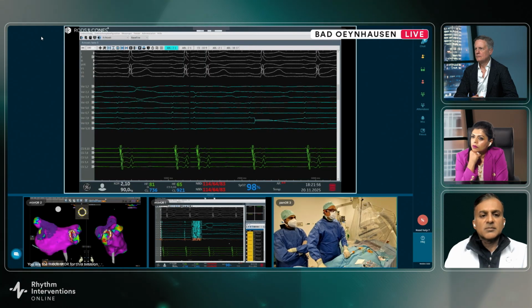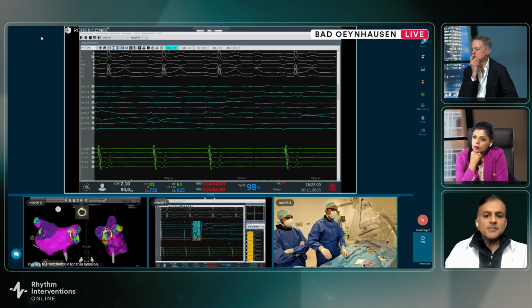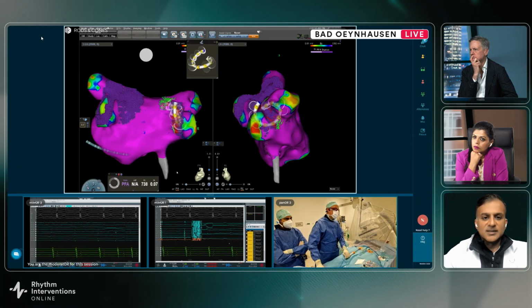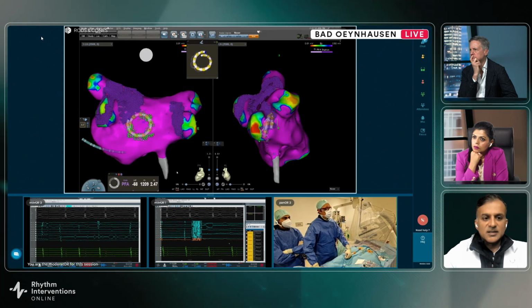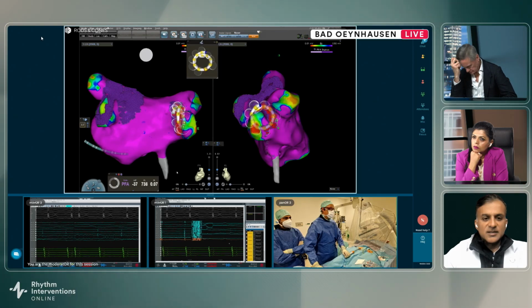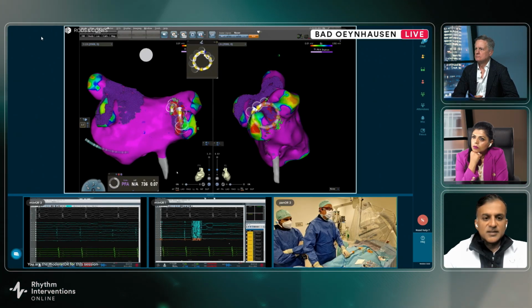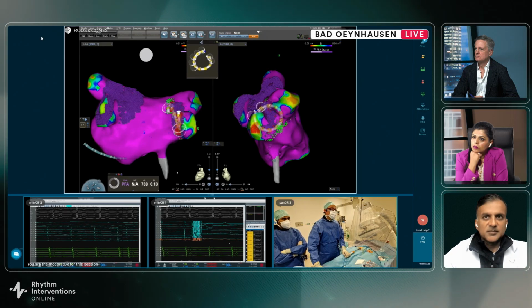We open the catheter once again to cover also some pieces of the maybe posterior parts. Again, you see the majority is now red and we are dropping out. So we need to replace the catheter here once again, going into this area and opening it once again. Everything is red, so the system suggests not to continue ablation, but now here are some green spots. Please ablate here and go back to RIO position.